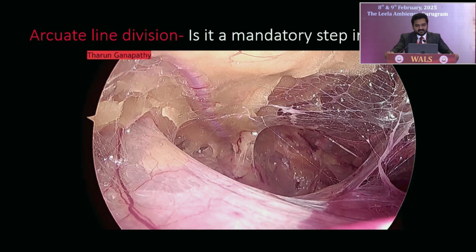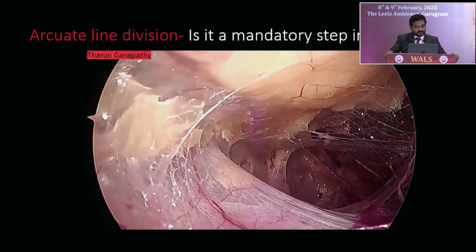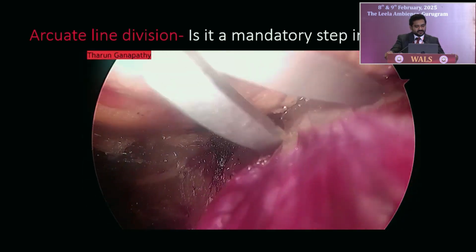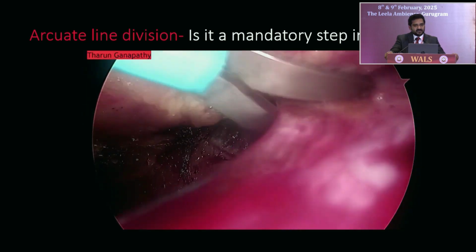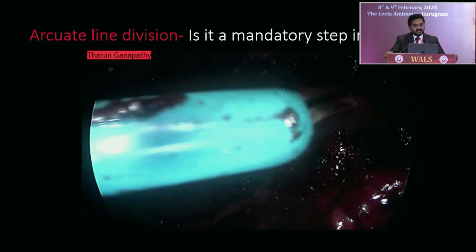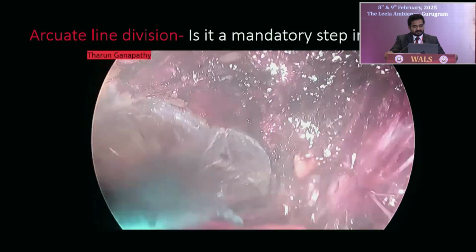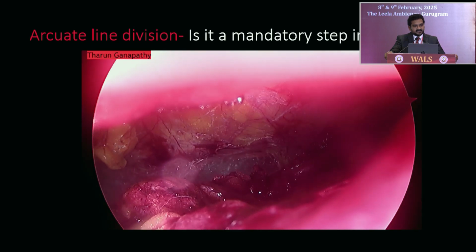So arcuate line division, is it a mandatory step or not? So after that, you'll be placing the first working port lateral to the inferior epigastric vessels. You can see the vessels there. Once that is done, you move on, take your attention to the arcuate line. The arcuate line, sometimes you can proceed without dividing it, but most of the times you need to divide the arcuate line at least for 2 or 3 centimeters, or sometimes all the way till the level of umbilicus to place the next working port, that is immediately below the umbilicus. So once that is done, a needle can be placed, and the second working port can be placed.